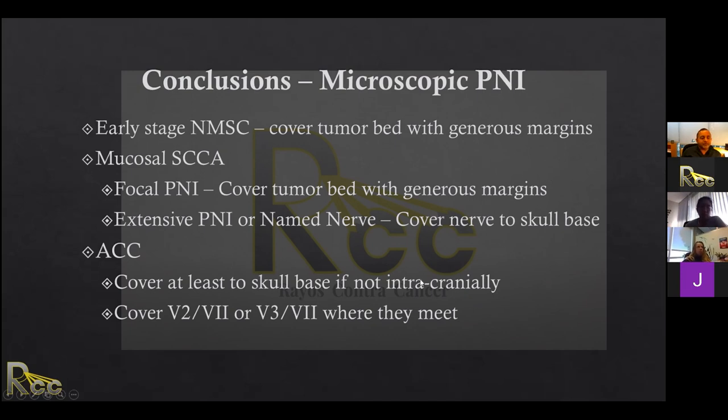I would say really with modern radiotherapy, if you're using IMRT, and I'm going to let Mariel talk a minute about that, the IMRT versus protons, that's always a big discussion. Mariel, what are your thoughts? I think it depends on your confidence with your setup and that sort of thing, your imaging. I think we do a pretty good job with modern day VMAT.